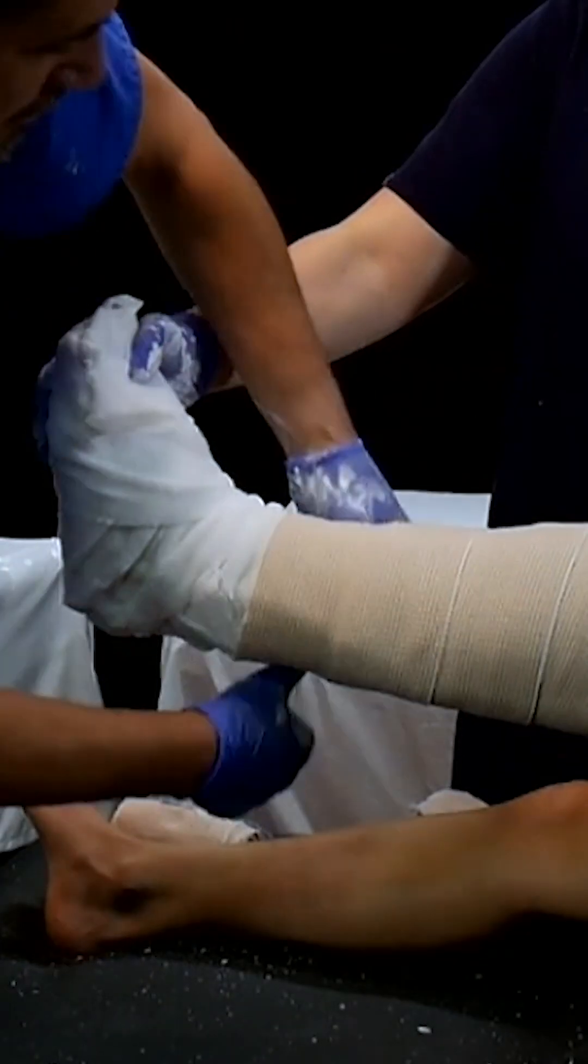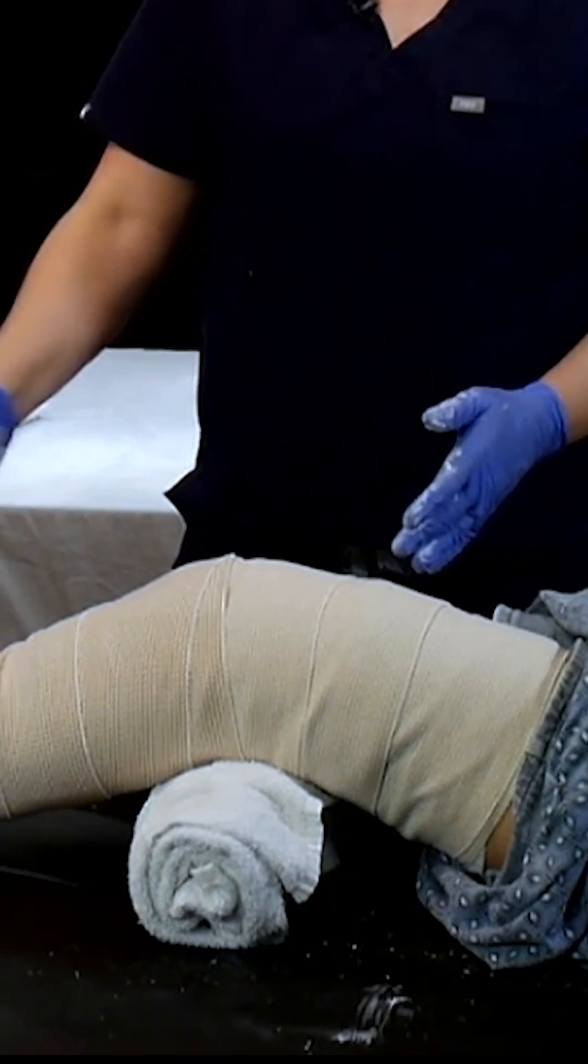Now we are good to go. So Lee can go ahead and wrap with that elastic bandage. It takes 5 to 10 minutes for this to dry. It's really important that you hold this until it's completely dry.